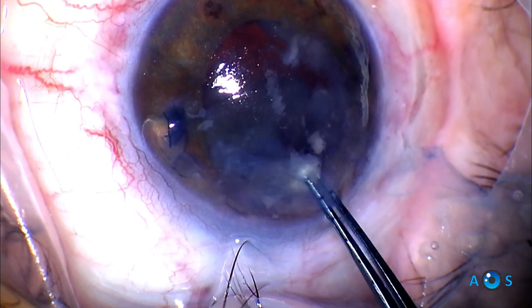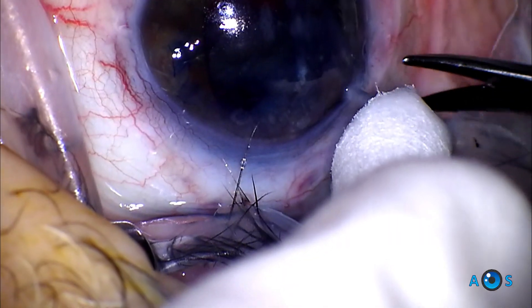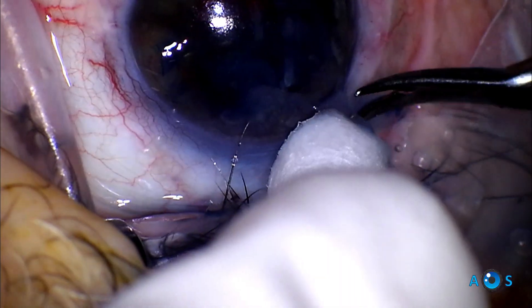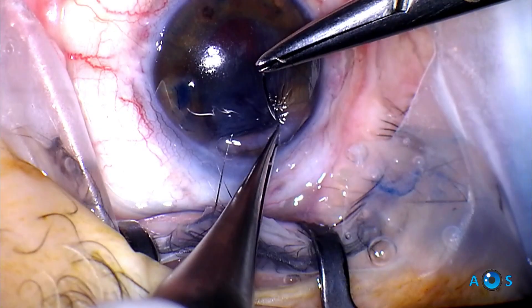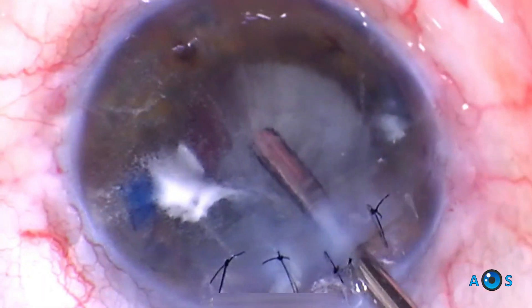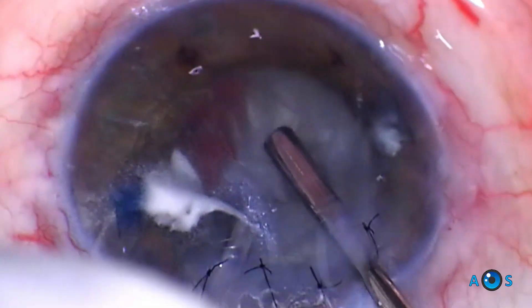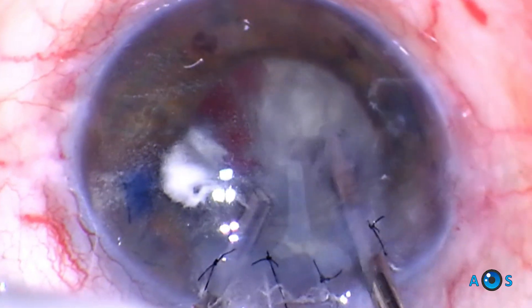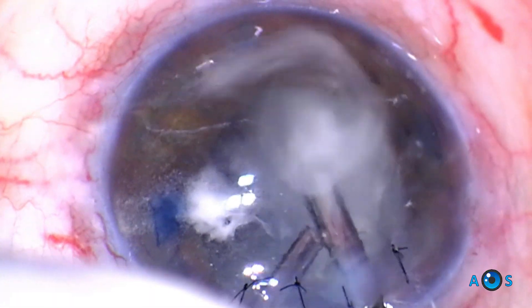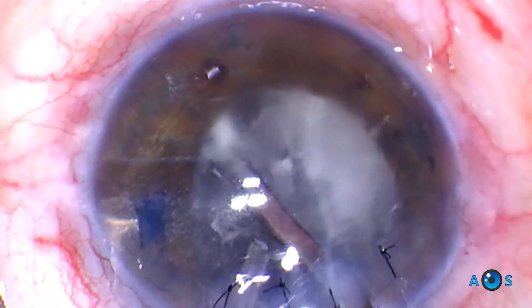Small cortical remnants may be grabbed with the rhexis forceps, but considering there is vitreous in the anterior chamber it is better to use the Vannas scissors to cut the vitreous strands. Then proceeding with suturing of the enlarged corneal incision, four interrupted 10-0 nylon sutures are placed before advancing to triamcinolone-assisted anterior vitrectomy. The manual vitrectomy is now performed using cut-IA mode first, with highest cut rate and moderate vacuum. The goal is to clear the vitreous strands from the anterior chamber.